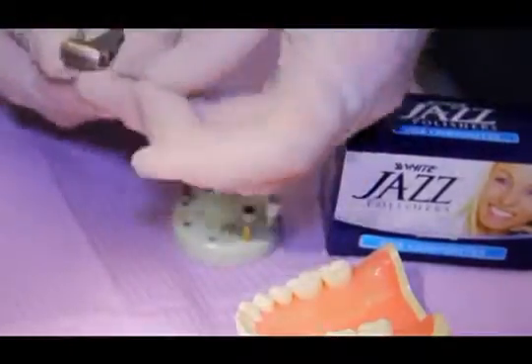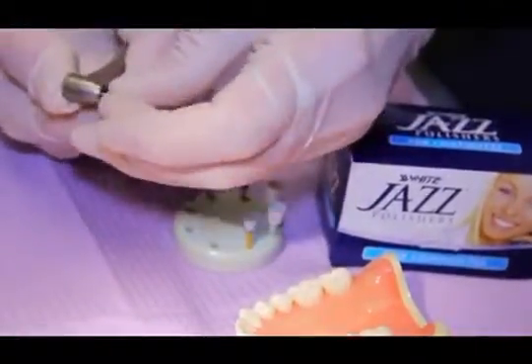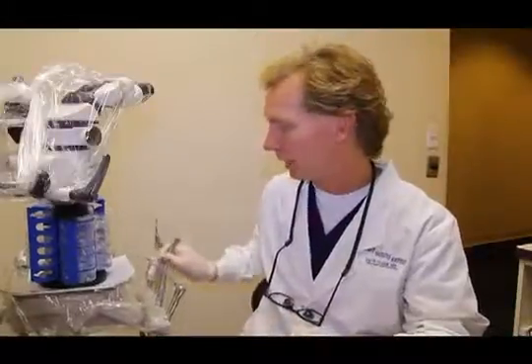If you have an electric handpiece, we're going to change it from a setting of 40,000, I really have two settings, fast and medium, down to about 12,000 RPMs. They have a lot of torque, and that way the brownie doesn't explode. If you run these in your air-driven handpiece, that's okay, but remember, if you run them at full speed, they'll explode, and they create a lot of heat.